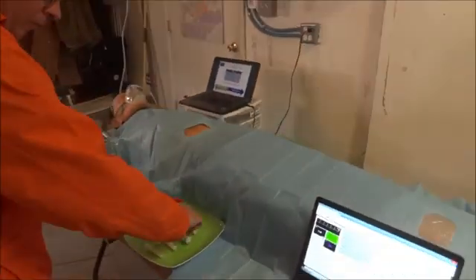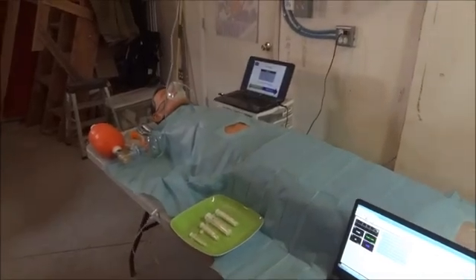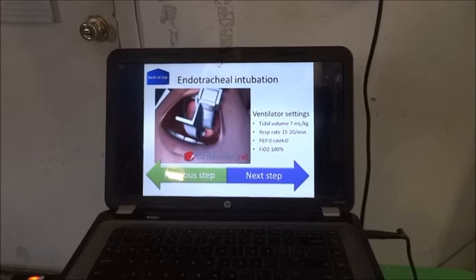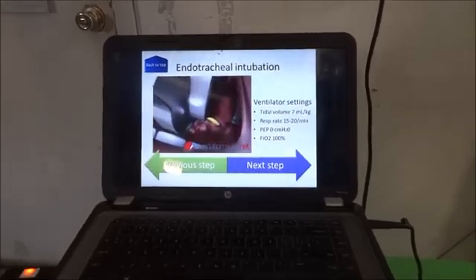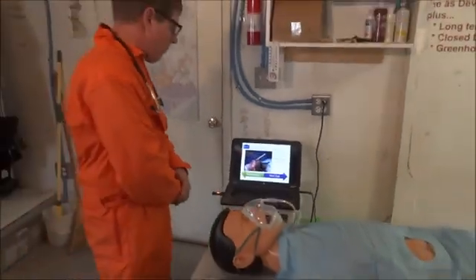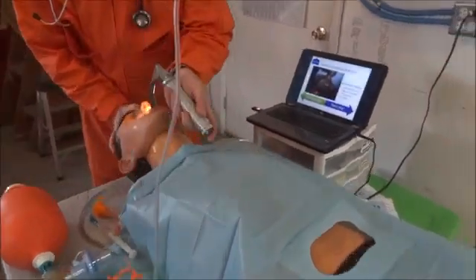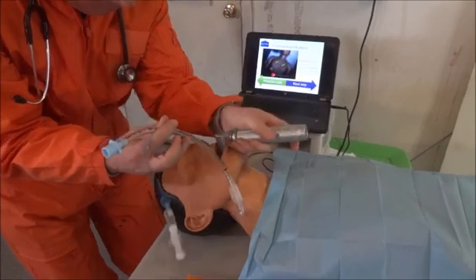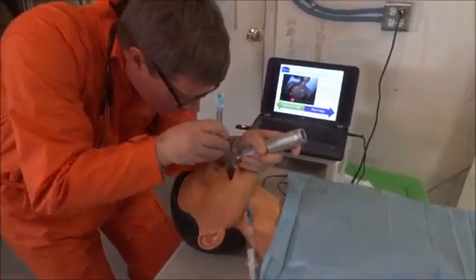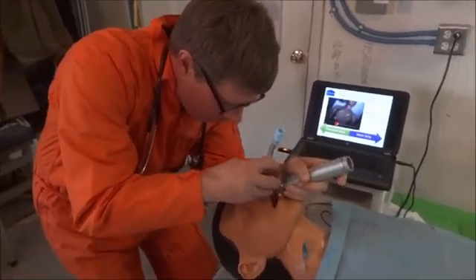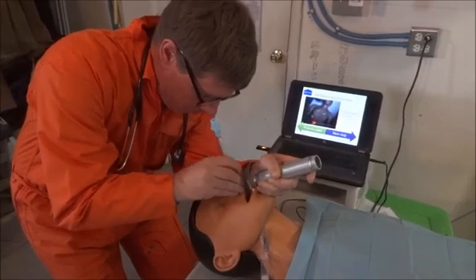The patient is now anesthetized and needs to be intubated, which is the next step corresponding to endotracheal intubation. To that purpose, there's another video in the PowerPoint explaining this procedure, which is somewhat complex. The participant is just reviewing the video before attempting the procedure. It's a difficult procedure — learning curve studies show that you need around 60 procedures to reach a 90% success rate.